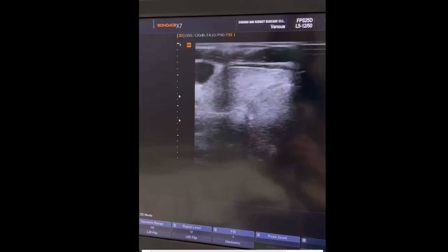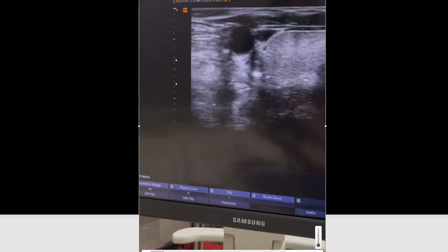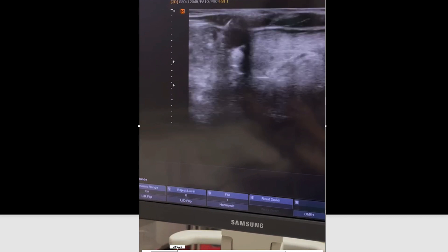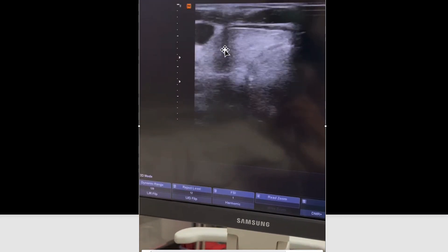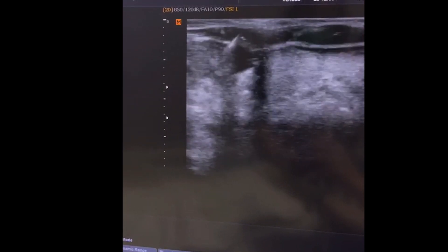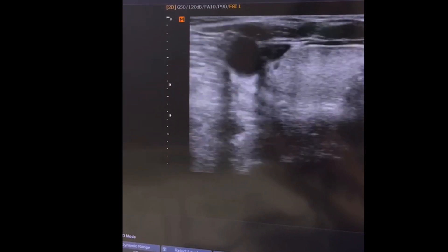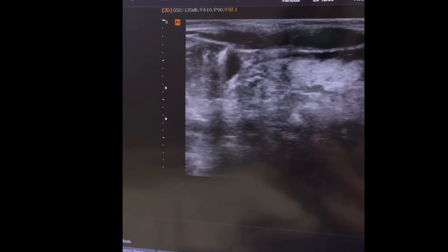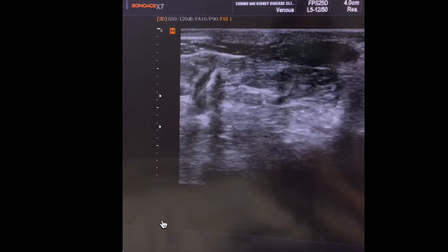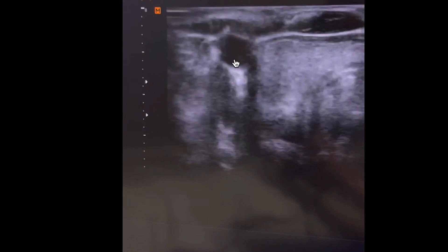And here is another view — I'm trying to do a guidewire ultrasound confirmation. What you see is the guidewire is not in the carotid artery. This patient I have successfully placed a permanent catheter, so this is not a complication. The guidewire here is actually in the jugular vein. Look closer — this is the jugular vein, and if you wait a little bit you can see the guidewire actually enters here into the brachiocephalic vein.